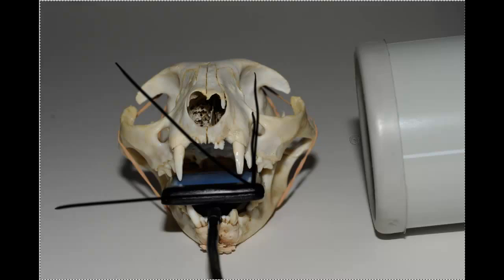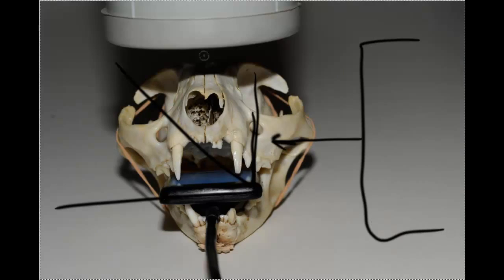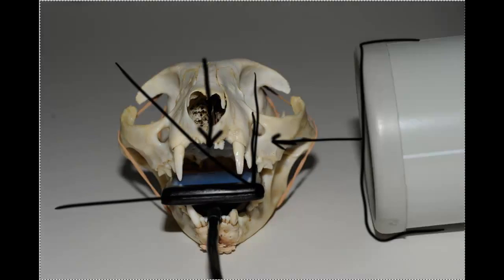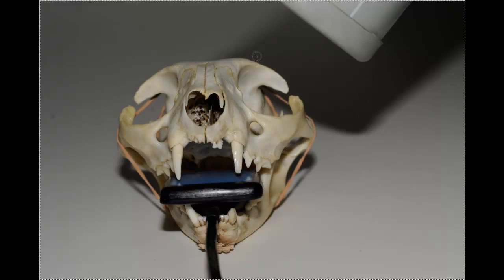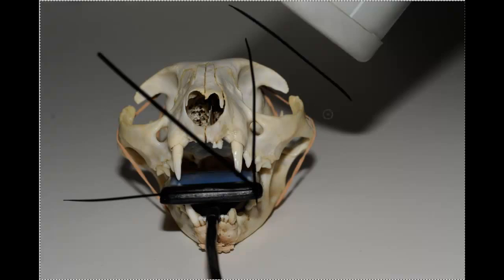So the easiest way to accomplish this is to take the x-ray cone that we see here, and point it directly at the teeth. So we're visualizing this from the front because we're pointing this cone directly at the side teeth. Then we want to point it directly at the sensor. So here we are looking straight at the teeth, straight down at the sensor, and then when we split the difference, we can see pretty much that we are parallel to this angle here.